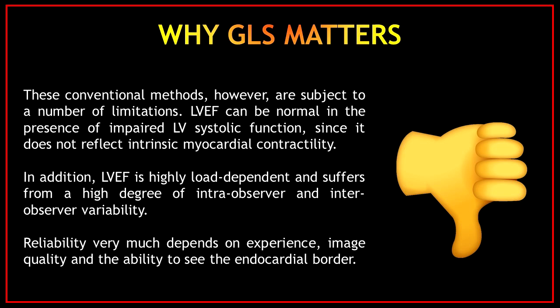Left ventricular ejection fraction can be normal in the presence of impaired left ventricular systolic function, since it doesn't reflect intrinsic myocardial contractility. In addition, left ventricular ejection fraction is highly load-dependent and suffers from a high degree of intra-observer and inter-observer variability. Reliability very much depends on experience, image quality, and the ability to see the endocardial border.